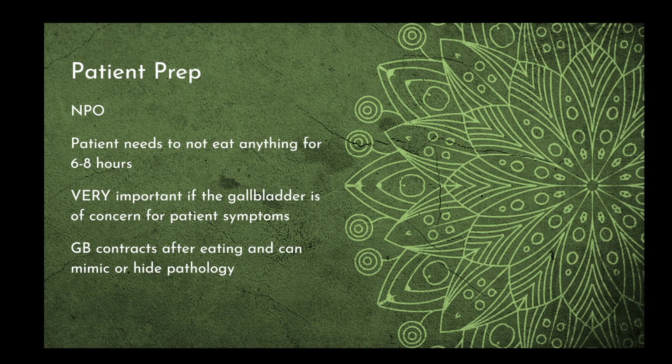Patient prep I've already kind of touched on. It is NPO for 6 to 8 hours. We really want that patient to be NPO if they can be. If they can't, not the end of the world. We're going to do our best regardless. Patients who are inpatient might not be able to not eat due to other medical reasons. Children, it's kind of hard to get them to be NPO for too horribly long. So if we can, 6 to 8 hours is ideal.